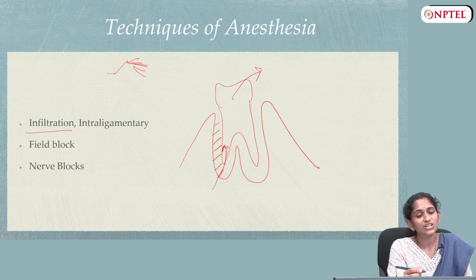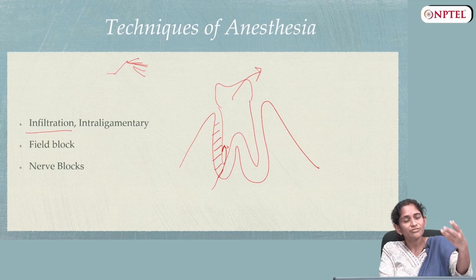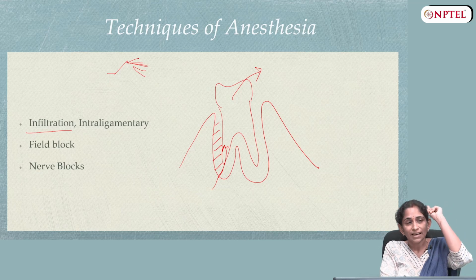So, infiltration is only given in areas where the incision is placed. You just flood the area where you are placing your incision by giving local anesthetic solution. That is what an infiltration is.